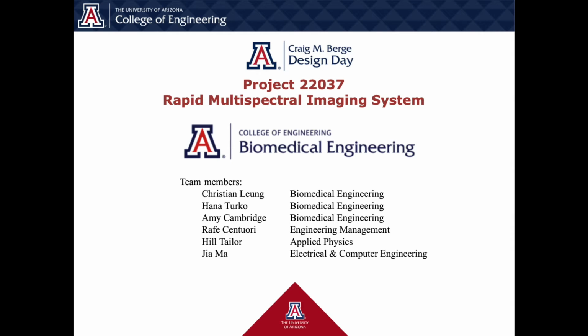This is the design day video for Team 22037 Rapid Multispectral Imaging System.